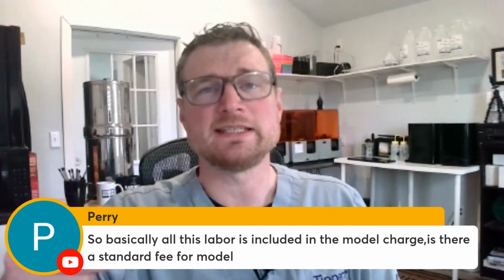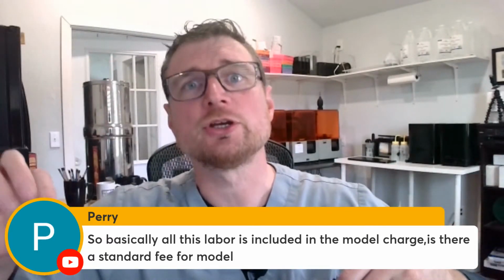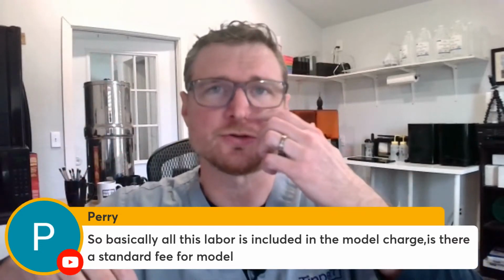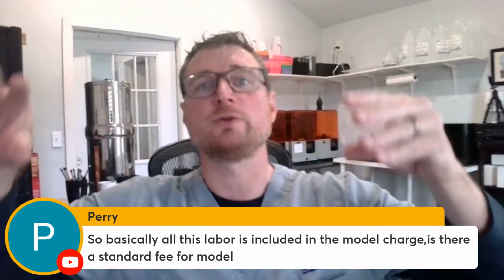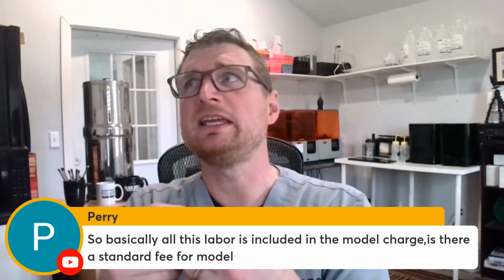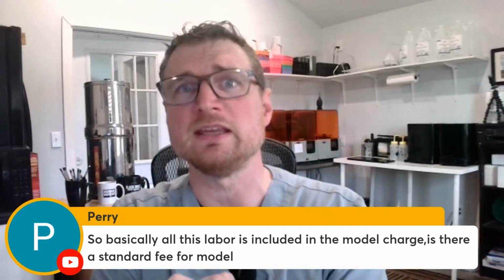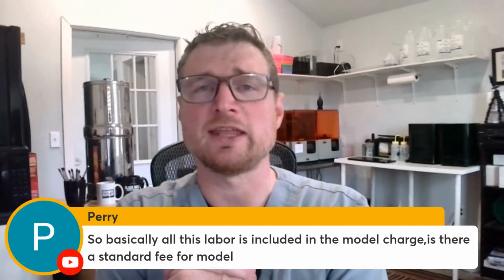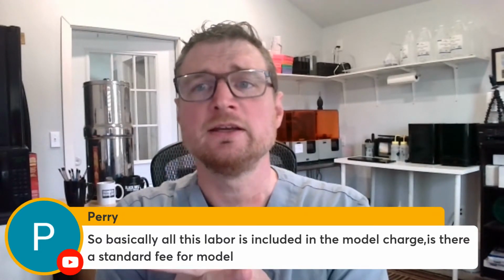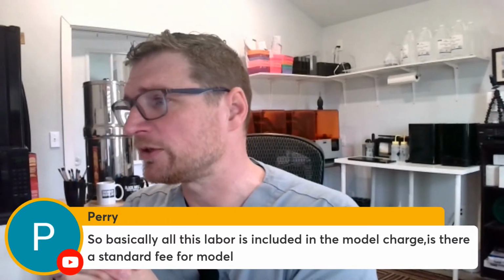So the ones that do auto basing, there is a per model charge. There's different structures now. EasyRx 3D, the ones where I just now showed the manual version of it, I don't believe there's a per model charge on that. I think it's just a base fee add-on for that 99. I think it's included in that 99. So yeah, basically all this labor is included in the model charge.